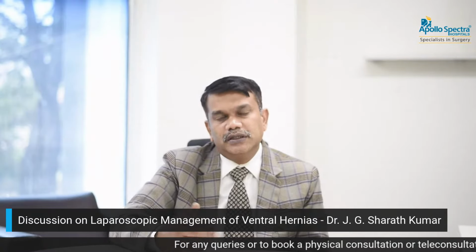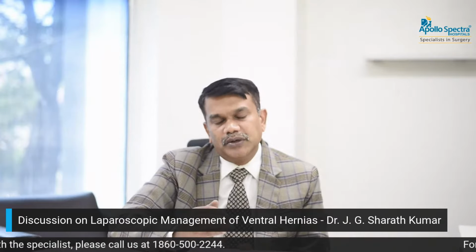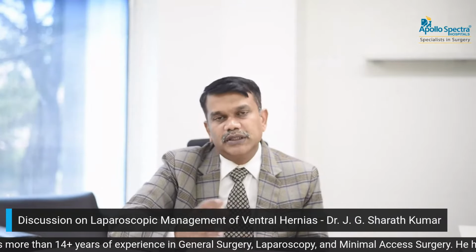Doctor, can you briefly explain about surgery? So the type of surgery we do, one is open or laparoscopy. We mainly use laparoscopic ventral hernia repair. Mesh or prosthetic placement is the standard repair. We'll use a technique IPOM or IPOM plus. IPOM means intraperitoneal onlay mesh without closing the defect, which can be done when the defect is less than 2 centimeter. When the defect is more than 2 centimeter, we can use IPOM plus. It's called intraperitoneal onlay mesh with defect closure and placement of mesh.